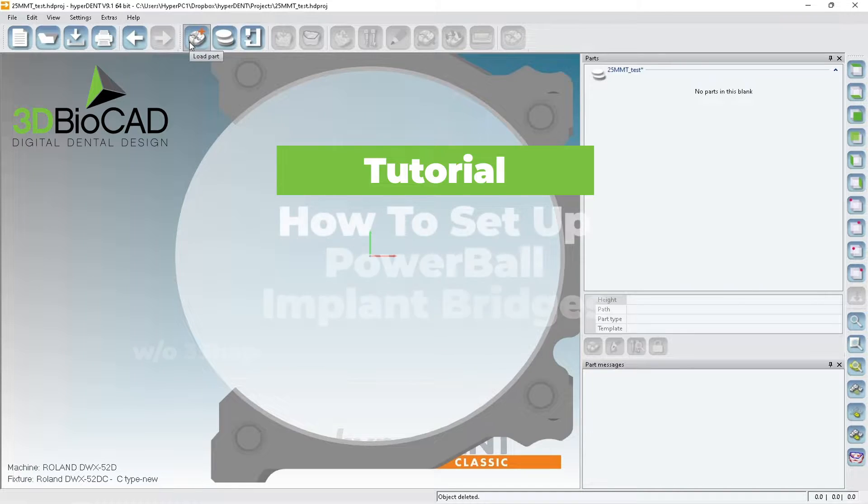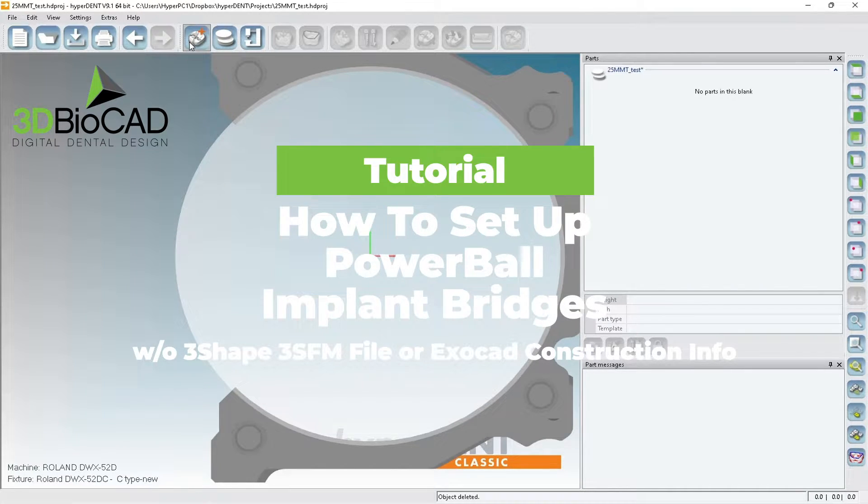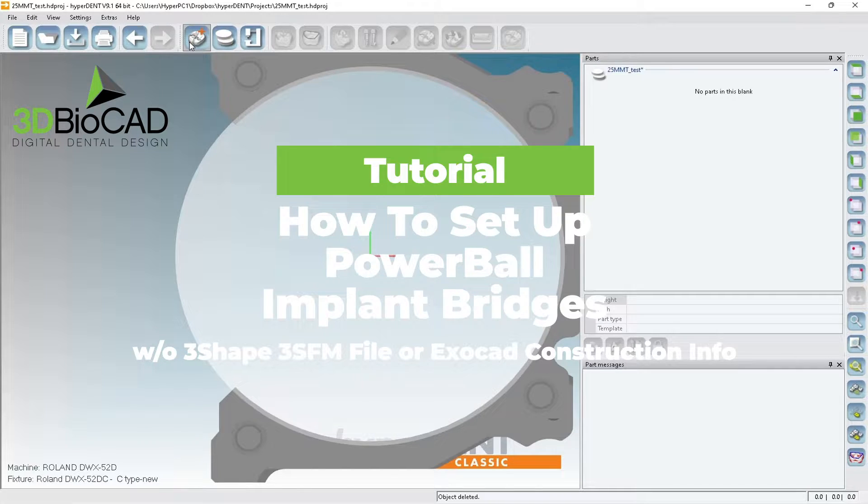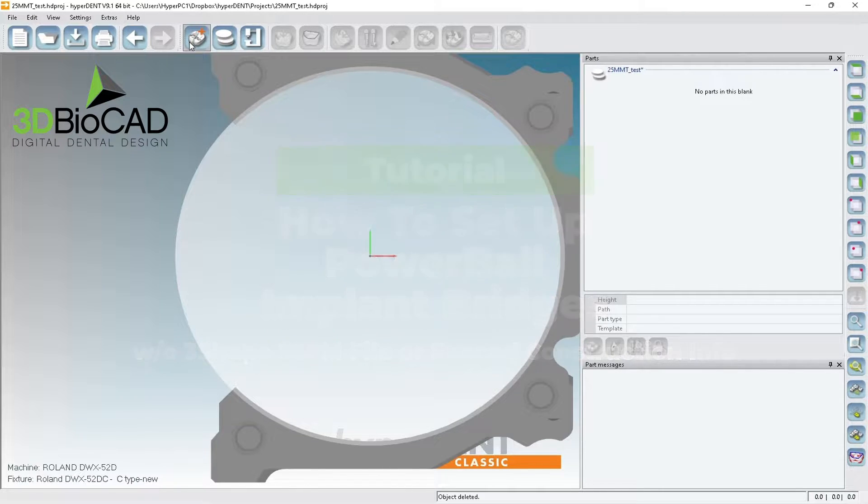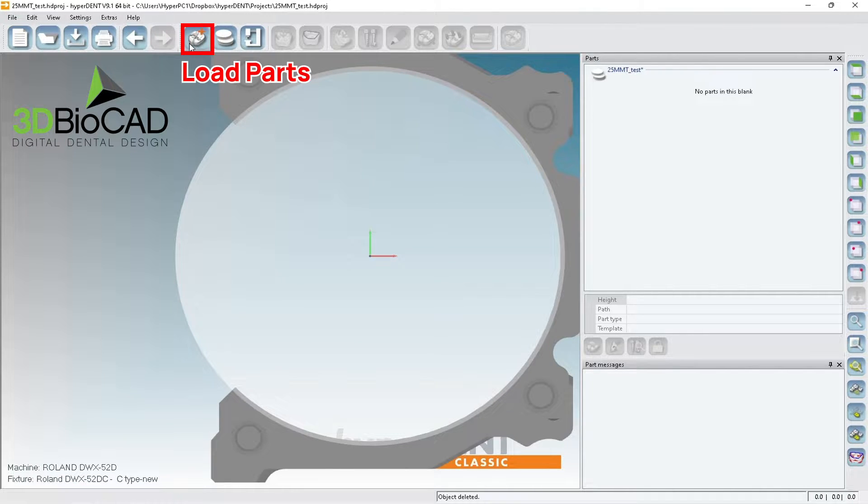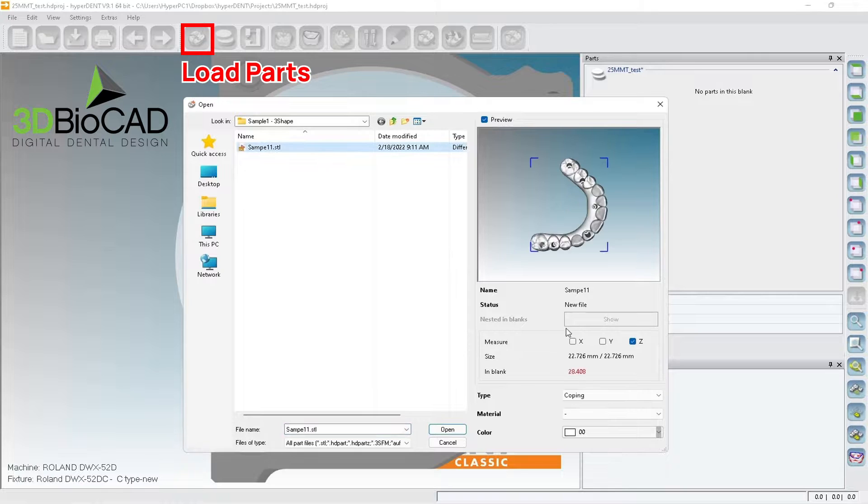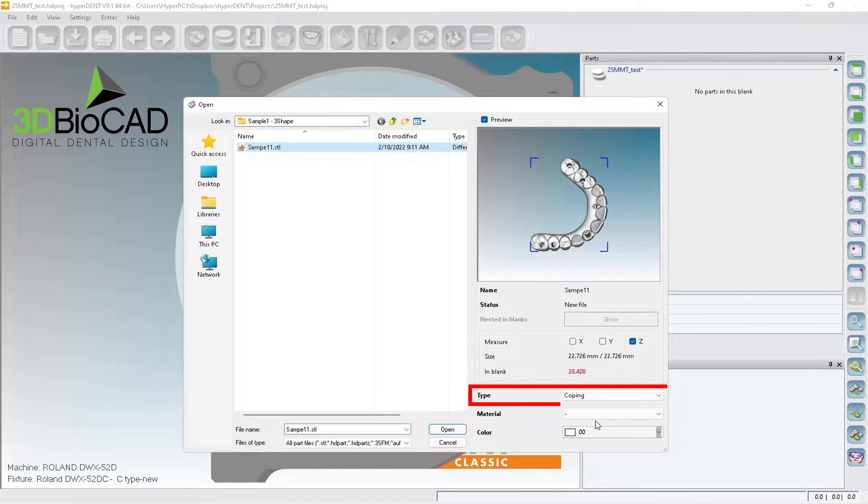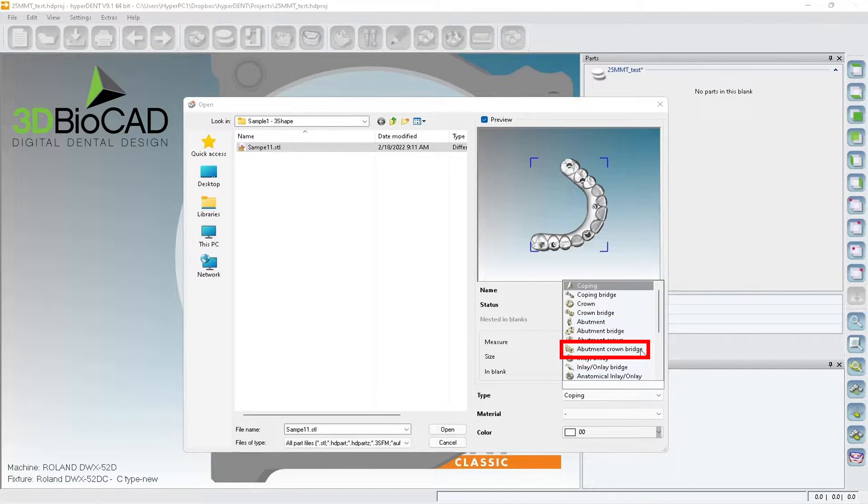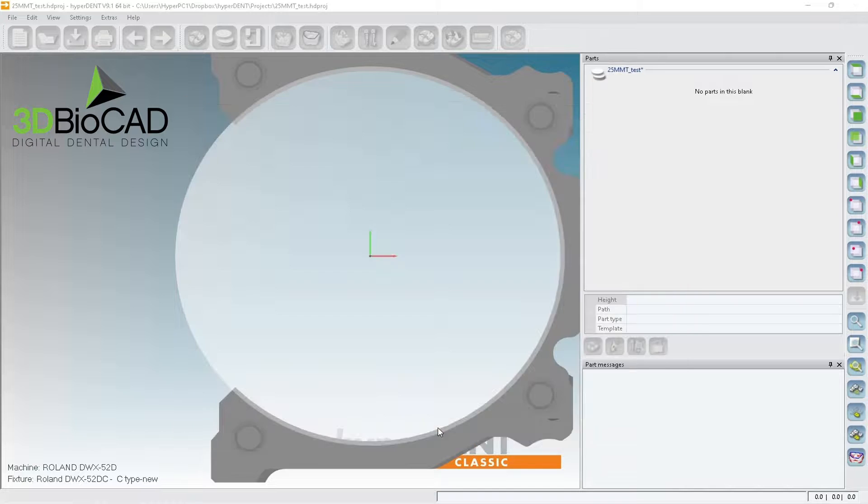In this video, I want to show you how to identify all this information by yourself if you don't have construction info or 3SFM file. Sometimes you might have wrong information from construction info as well as 3SFM files, so it's good to learn how to manually select all this information. So let's go ahead and bring the case. If you don't have those informations, it'll bring it as coping. First, make sure you choose Abutment Crown Bridge and then open.